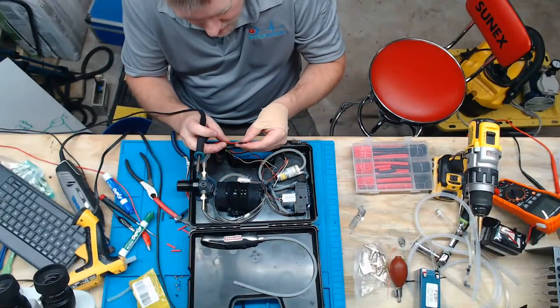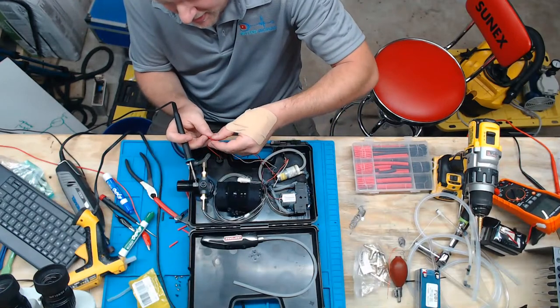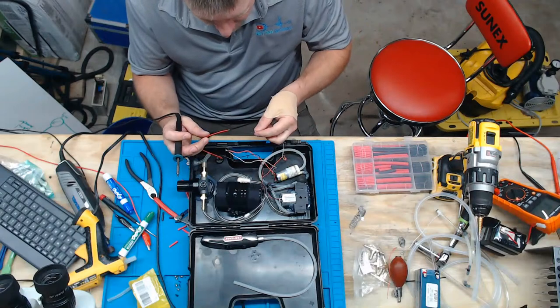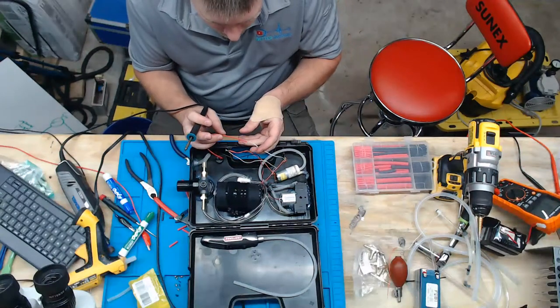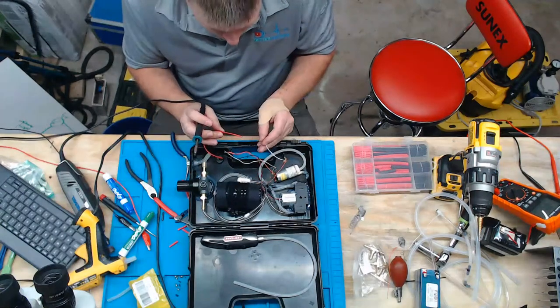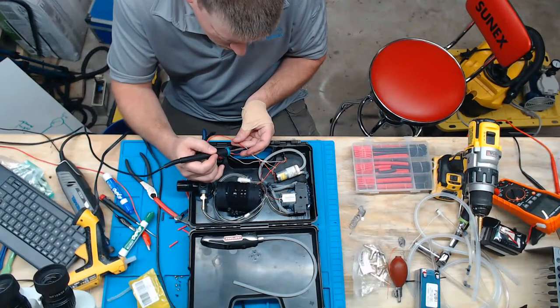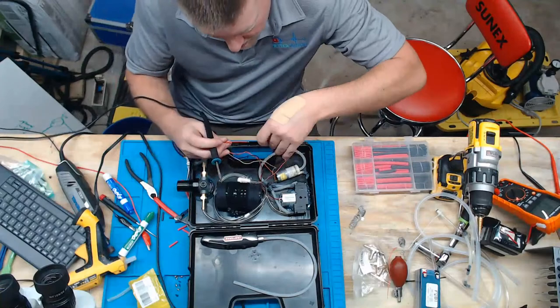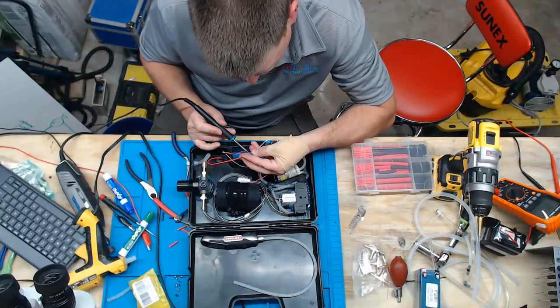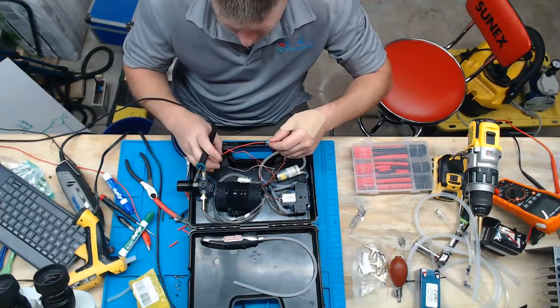Let's see, put some of this action on. I'll actually stick with the color code, red to red, black to black. Doesn't really matter. Why not? All right. So the first thing I am going to tin is going to be my white, which is going to be my positive on my barrel connector. Here we go. Man, normally I don't have this kind of problem. There we go. That's better. Nice and neat, guys. Nice and neat. Okay.